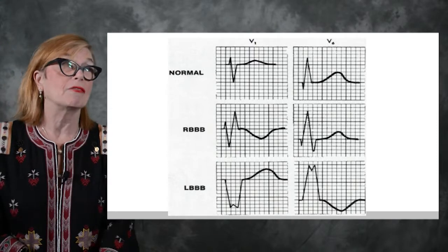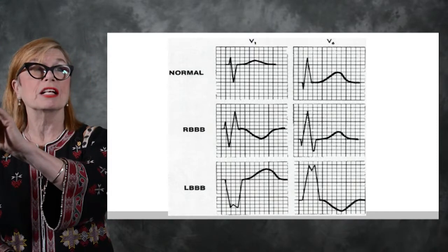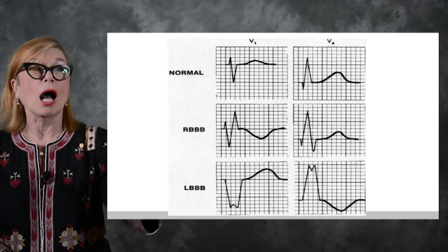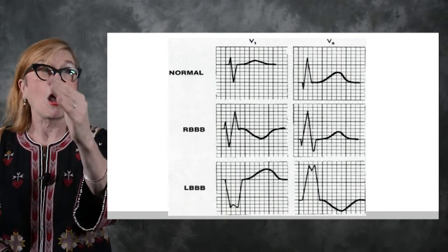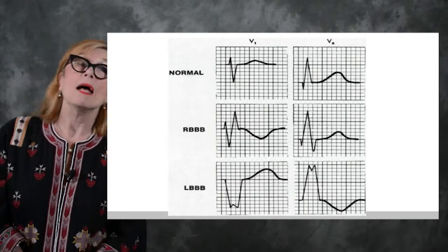Remember, just like the alphabet, find the R. In front of it, a downwards, that's a Q. Behind it, a downward, that's an S. That's the P, Q, R, S, and of course, ultimately, the T.